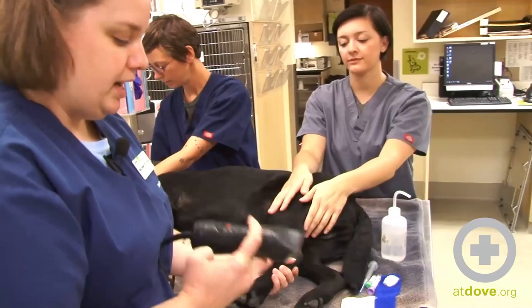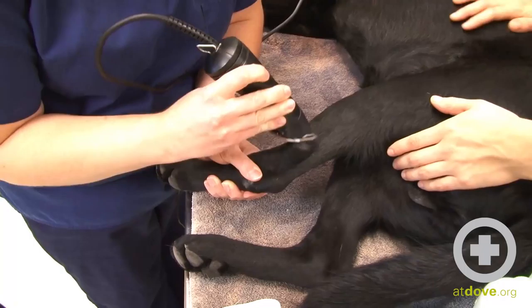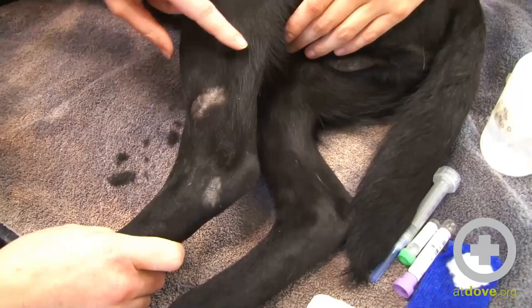Now in this dog, I'm going to clip a little bit of hair so that we can see things a little bit better. So we'll just shave a small area. It's proximal to the hock here, so you can kind of see where this vein goes. Here's the vein.